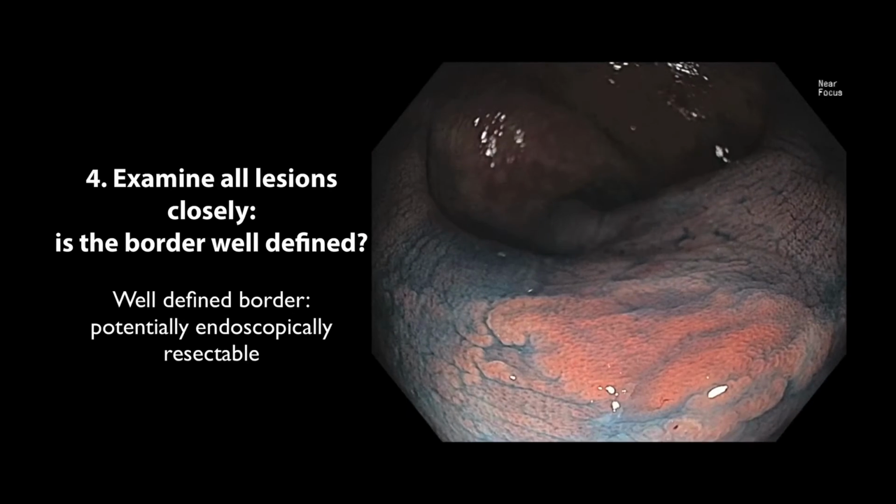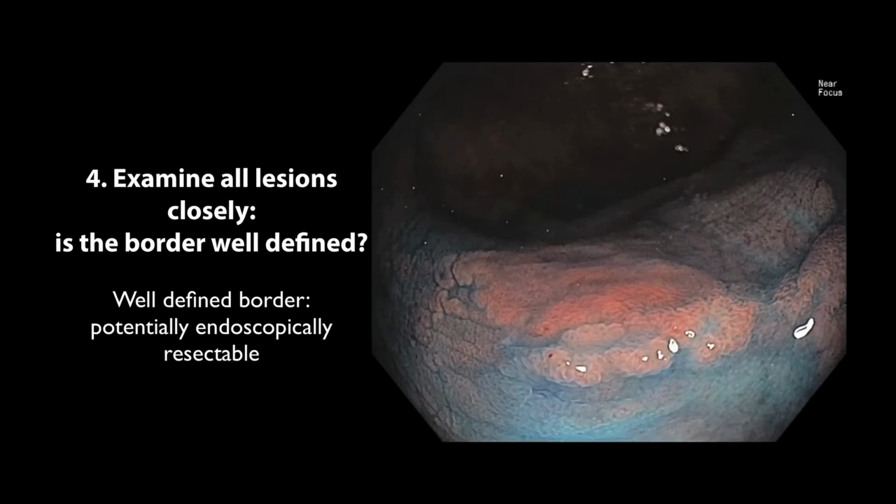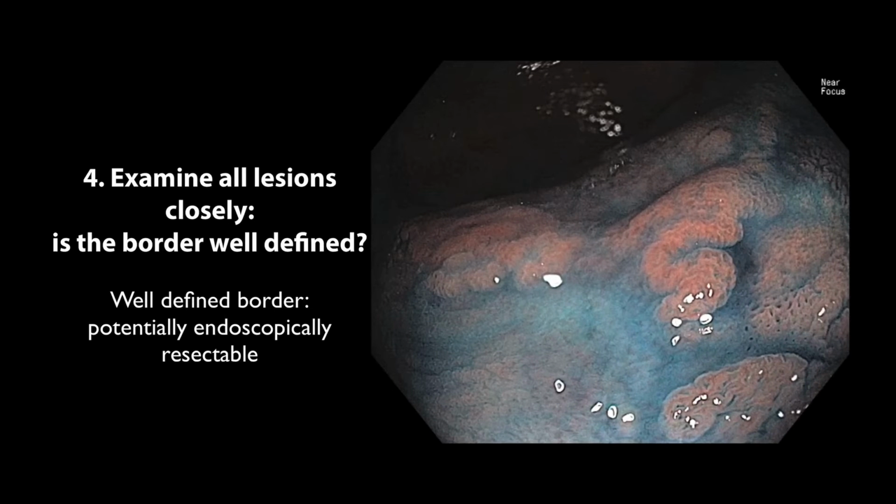A slightly elevated lesion is poorly visualized with high-definition imaging in a region involved with colitis. Upon application of dilute indigo carmine, a large, flat neoplasm is well seen, which has discrete margins, and it appears to be much larger than initially predicted by white light imaging. The lesion was felt to be endoscopically resectable and was removed with ESD.